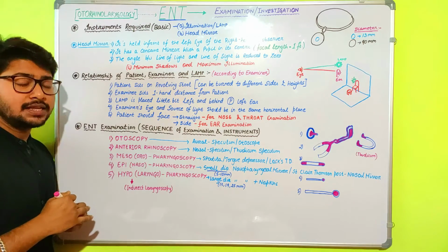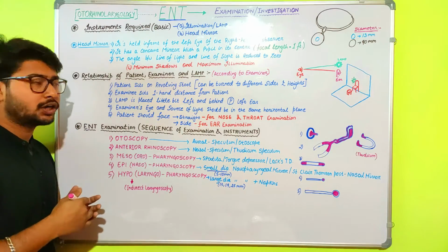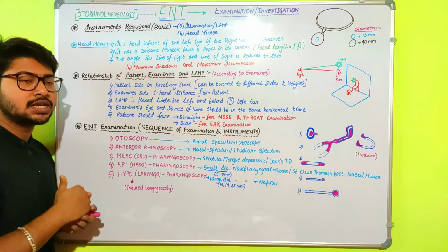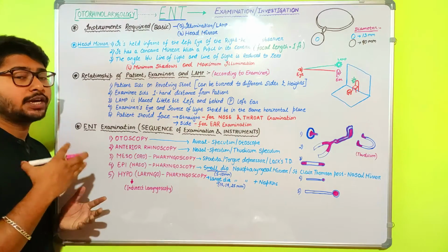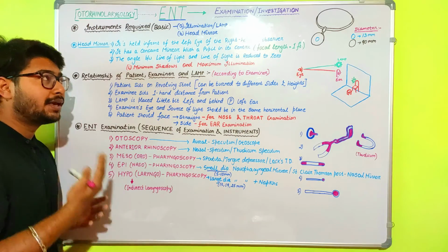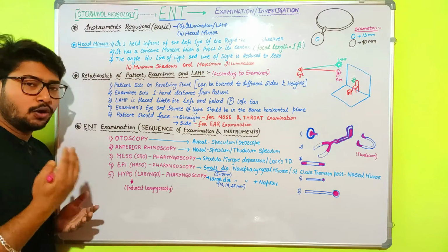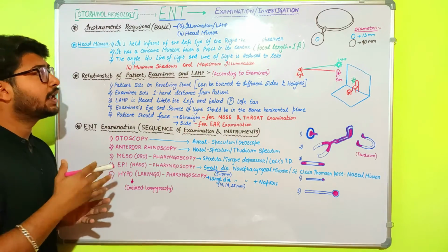In this video we are going to discuss that if a patient comes to the doctor and asks to be examined about the ENT organs, then what are the procedures that the doctor should follow? That is the first prior information that you should know about ENT. That's why we are going to begin the subject with the procedure of examination or investigation of ENT organs. So what are the basic requirements or instruments required in ENT?